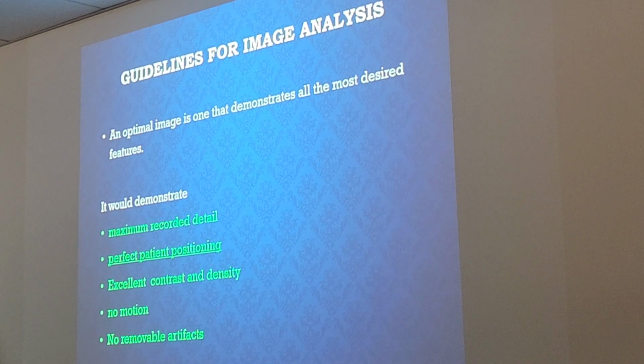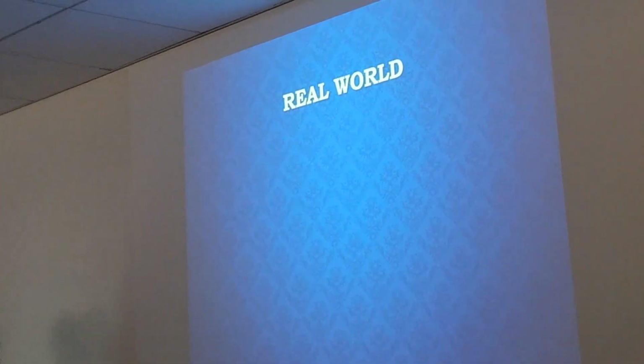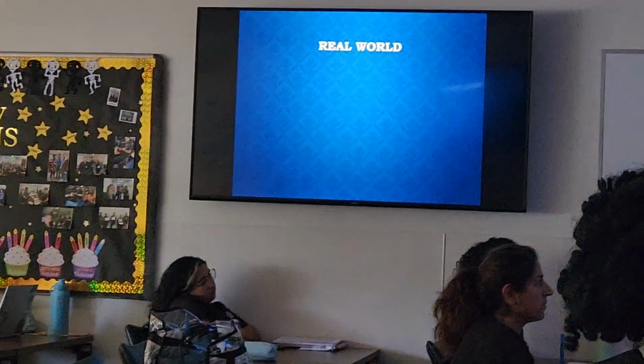And what else did we say last week? We should see the outline of the heart, air-filled trachea, correct? Okay, positioning. Apex to costophrenic angles clearly visualized. And then 10 ribs, telling us that it was good breathing instructions. And of course, we don't want to see any artifacts such as the snaps in the bra, leads on the EKG, necklaces, good, yes.